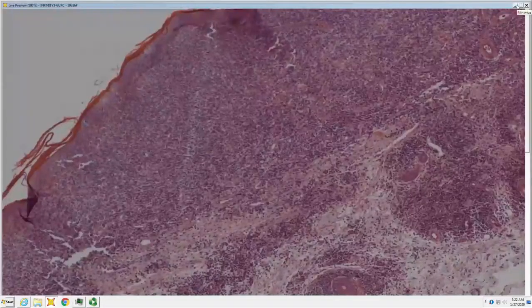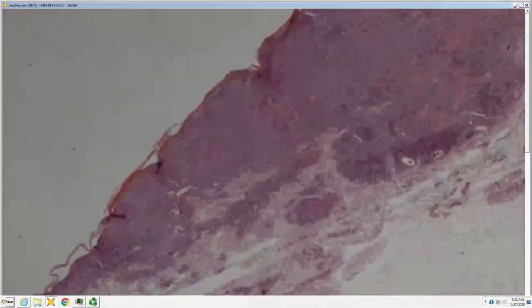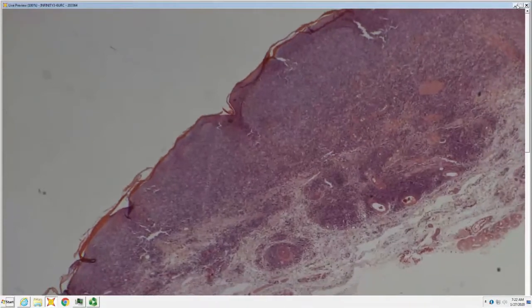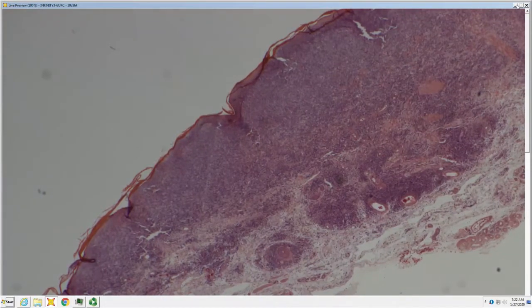Okay, so this is our second session on lymphomas, and we're going to cover some of the basic principles. So for this first one, are we deep or are we top half of the dermis? We're top half and broad and band-like, right? Which is a T pattern, whereas B patterns tend to be deep nodules. So that's number one.